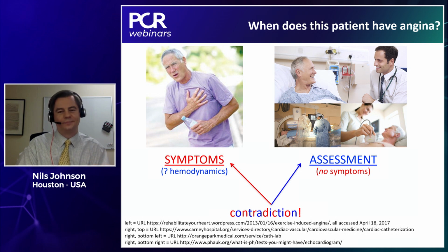We do stress testing in all branches of cardiology for a very good reason. And that's because when things are normal at rest, that doesn't tell us about what is or what is not happening under stress conditions. And so non-hyperemic pressure ratios, I think in my own mind, have a limited role to play given this fundamental piece of physiology that is autoregulation.